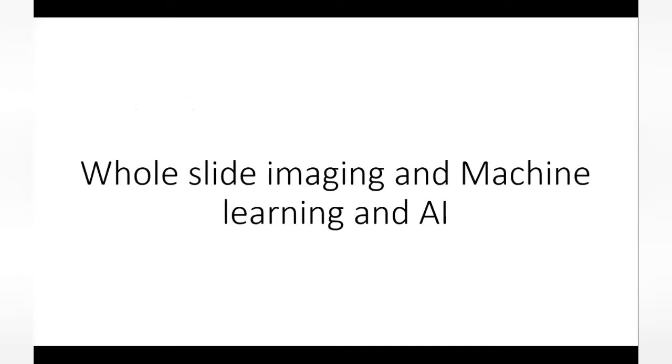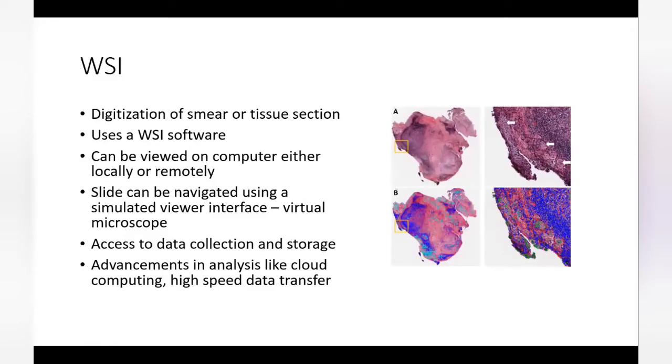Now, what is the meaning of WSI and machine learning and artificial intelligence? I think Sir has gone through it in detail. I'm going to just take a couple of minutes, or perhaps lesser, to get an idea of, in the laboratory context of things, there are two main terminologies and software understanding that you need to have when we're talking about digital pathology.